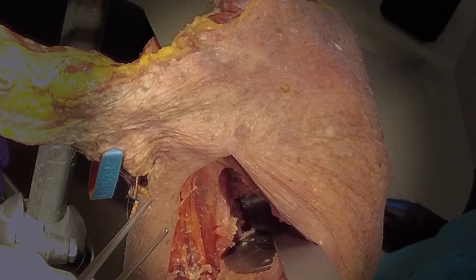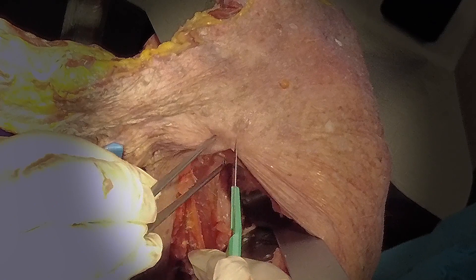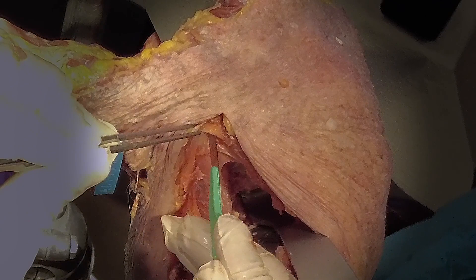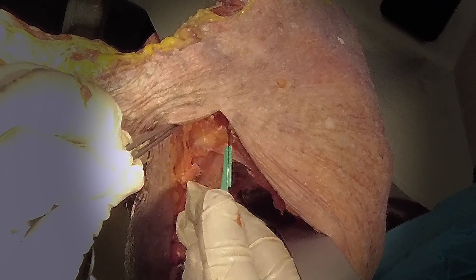Next, we move on to exposure of the coracoid. I am extending the incision slightly here because it's a cadaver for adequate visualization, but you don't typically have to do this. With GPS and coracoid block placement, my incision is typically only one centimeter longer. I don't typically go this medial — I'm just doing that to improve exposure for this video. I'm removing the soft tissue overlying the coracoid, mostly fat in this case.